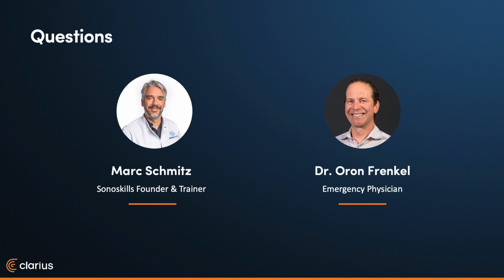Love it. Yeah, we should demo that maybe at a future webinar. Great. This is a common question I get a lot when I'm talking about shoulder ultrasound: how to differentiate partial versus full thickness tears, and grading partial tears. Do you have some guidance on how to do that?